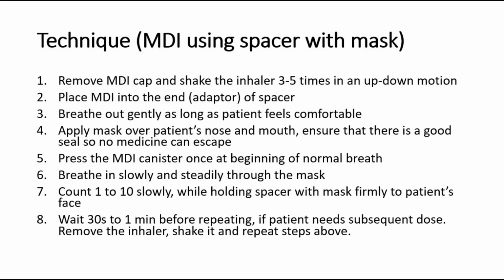Next, wait for 30 seconds to 1 minute before repeating if the patient needs a subsequent dose. So if they need another dose, remove the inhaler, shake it, and repeat the steps above. So that is the technique for MDI using spacer with mask.